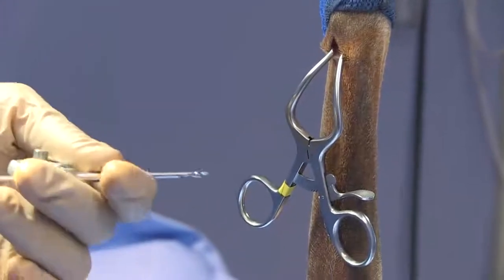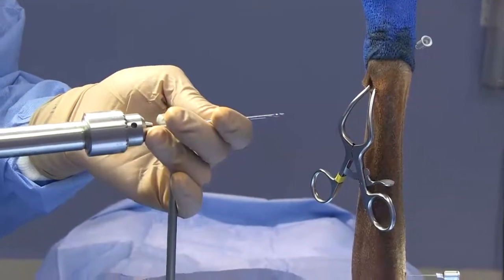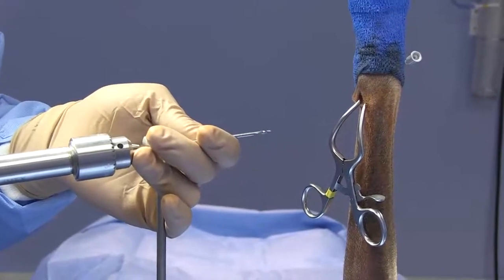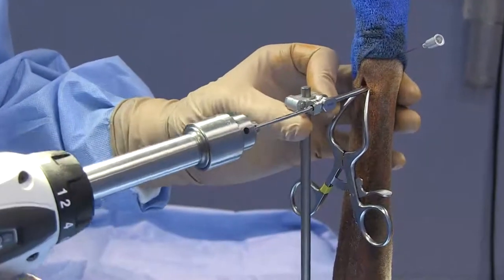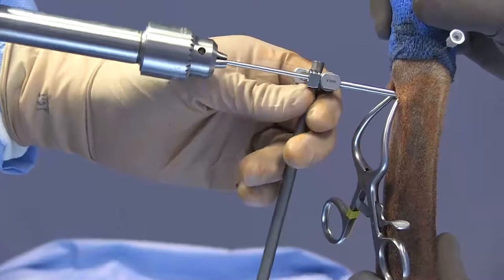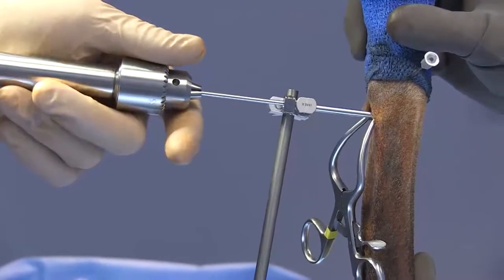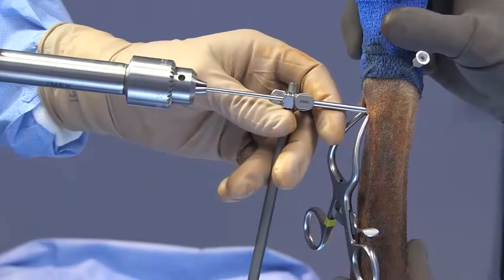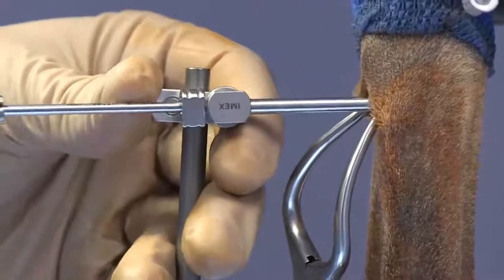One of the important things when placing these pins is to pre-drill your hole. We really try to stay away from inserting fixator pins directly without a pre-drilled hole, as it tends to cause a fair bit of osteonecrosis and can contribute to premature pin loosening. The drill bit we use is either the same size as the pin or just a tad smaller. With my handle and drill, I can assess where I'm at and make sure I'm drilling parallel to the joint — the carpus is here with our feeler needle in place.